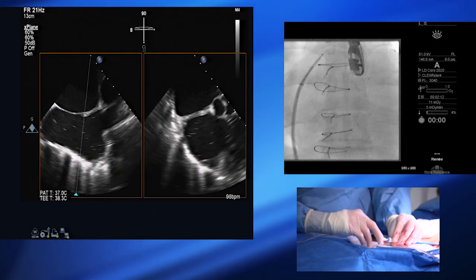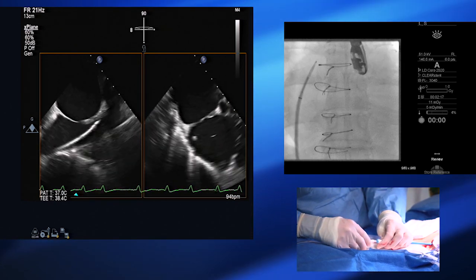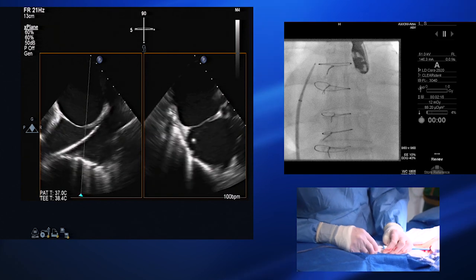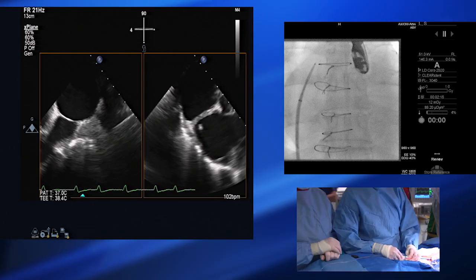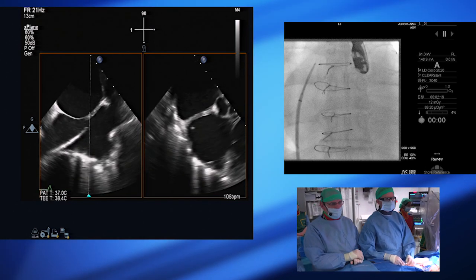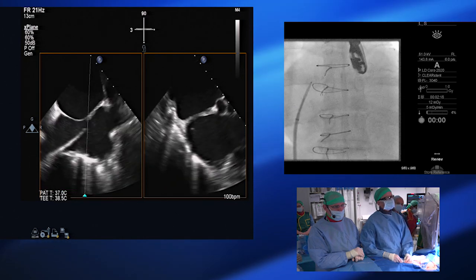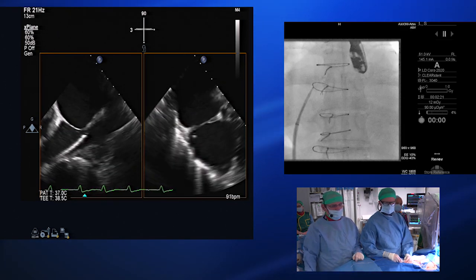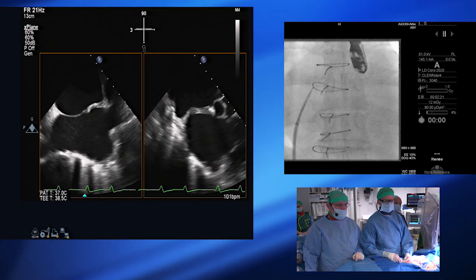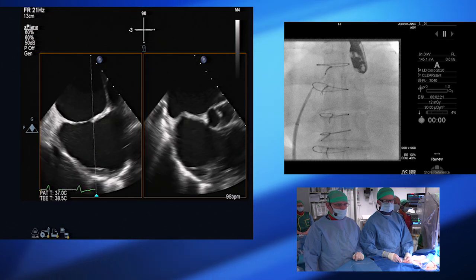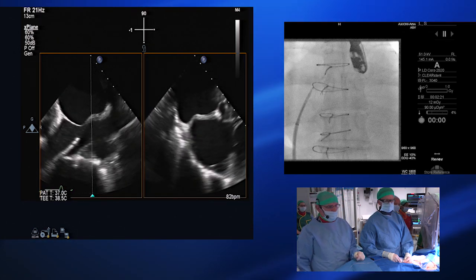We now have an SL0 catheter and a Baylis needle in the SVC coming down. What we want to be is posterior and inferior. The views on the TOE on the left show superior-inferior with superior on the right, and on the right we're looking at AP with anterior on the right. His septum has had some ablations before, so it is going to be more scarred, which is why the Baylis needle is quite useful here.